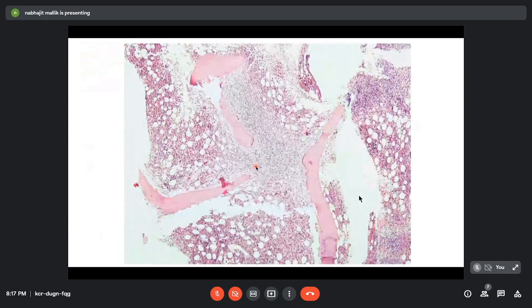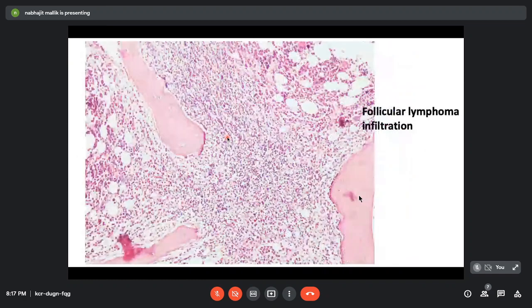They are disseminating into the surrounding structures, and this is probably a malignant lymphoid nodule. And when we take another look, we see that there is this trabeculae, and the lymphoid cells are all lined along the trabeculae. If we take a closer look, we can see that there is a junction of these three trabeculae, and the lymphoid cells are sleeving these trabeculae and forming these clusters around the trabeculae. So this was actually a follicular lymphoma with a paratrabecular infiltration, which is a very common pattern of infiltration seen in follicular lymphomas.